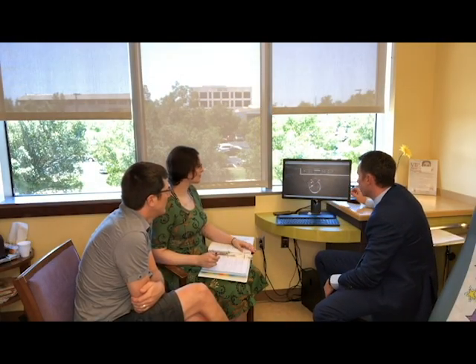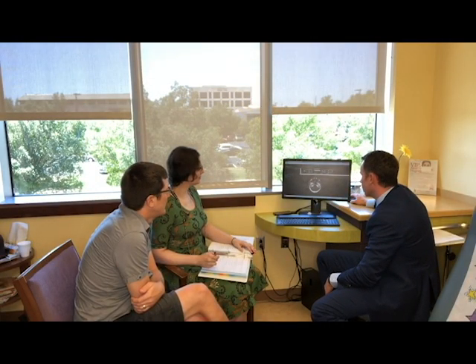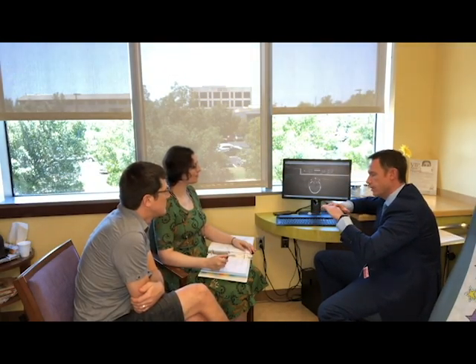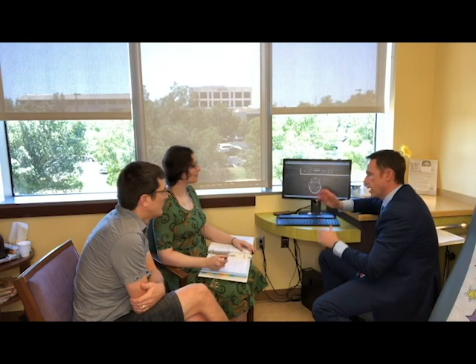The other option, which frankly is an oldie but goodie and has gone out of style a little bit, is just titanium mesh. It's a very hard metal that's like a lattice. It's very firm to provide structure and protection, but just bendable enough to allow us to contour it.